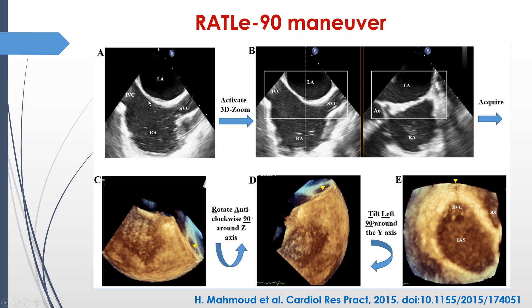Starting from the simple bicaval view that everybody knows — which is around 90 degrees, mid-esophageal view — we will have the left atrium, right atrium, superior vena cava, and inferior vena cava. Starting with this view, we will activate the 3D zoom mode on the machine. Once you activate 3D zoom, the screen will be divided into two small screens. The left-hand image will be your reference image — the bicaval view — and the right-hand image will be the elevation plane, showing you the anterior and posterior image.